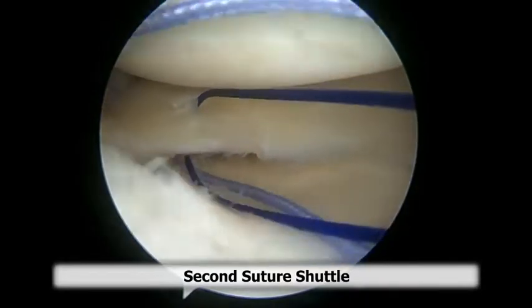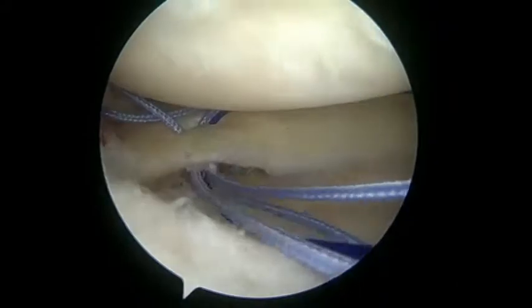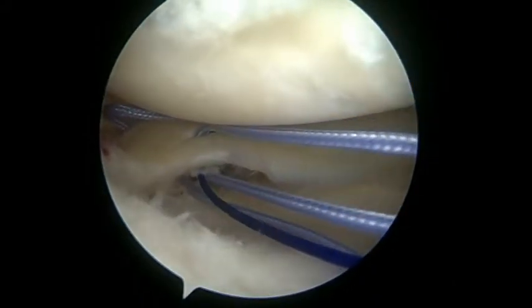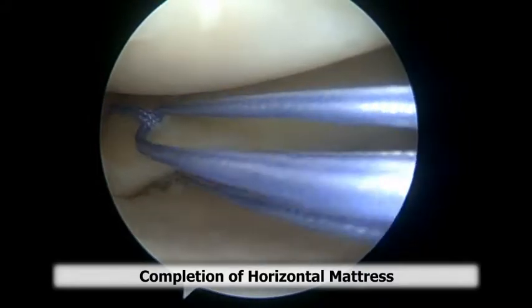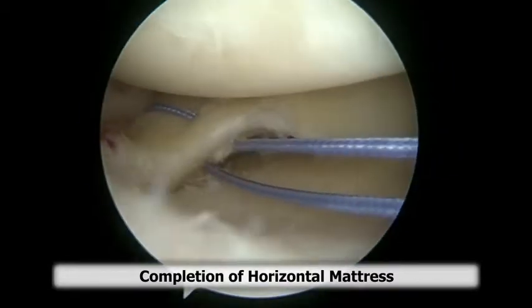The superior limb of the PDS will then be used to tie around the superior limb of the suture, and we will pull on the inferior limb of the PDS, bringing a horizontal mattress stitch through the meniscus.